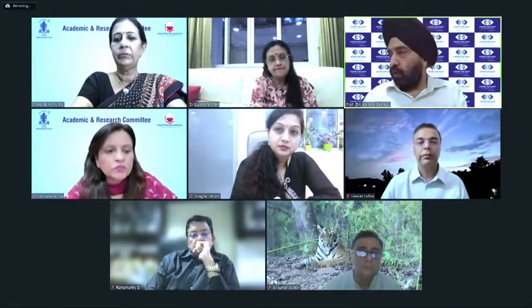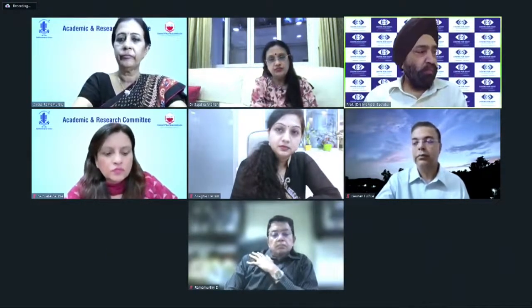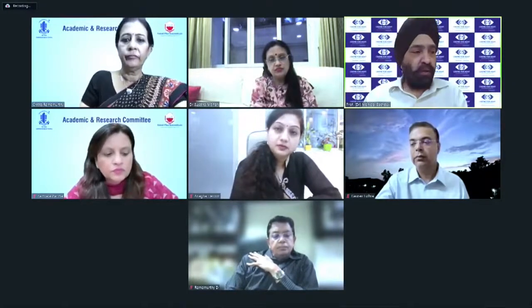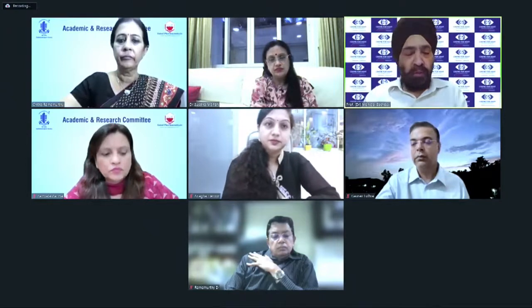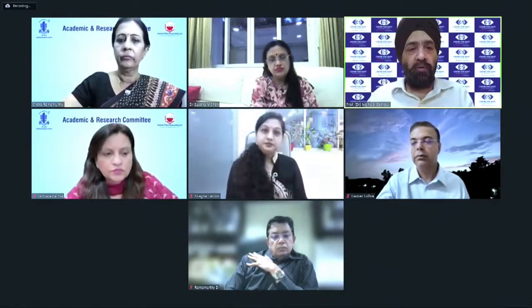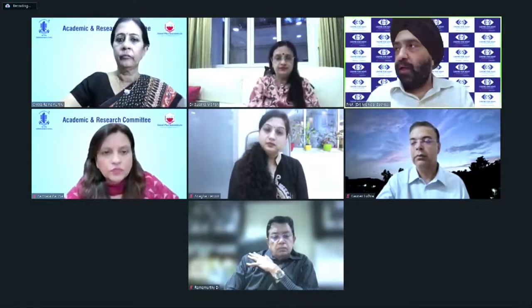Anyway, thank you very much. I have never done a PTK for flap striae removal. I personally feel that if a patient is coming with visual symptoms, often we ignore the patient and say okay, there is nothing. It's always better to do a full dilatation and do a retroillumination to get these striae into play and to see exactly how these striae are, whether they are in the center or not.